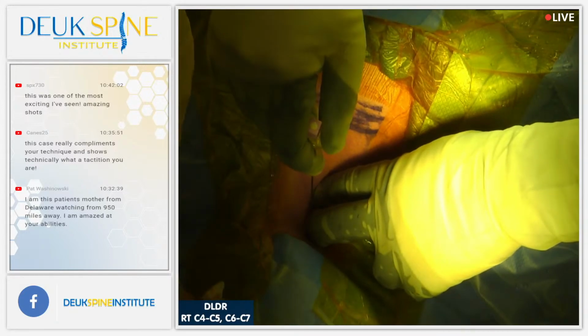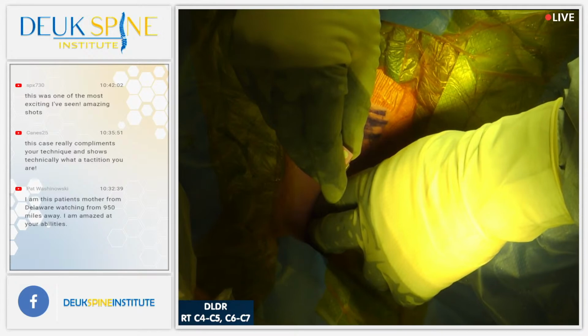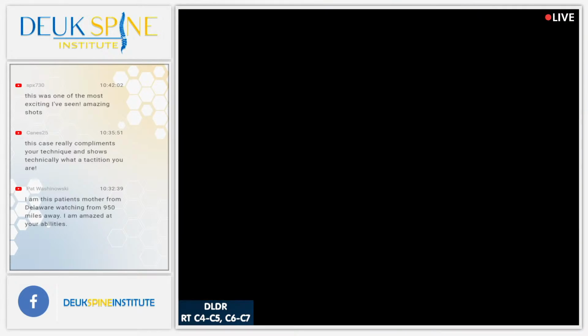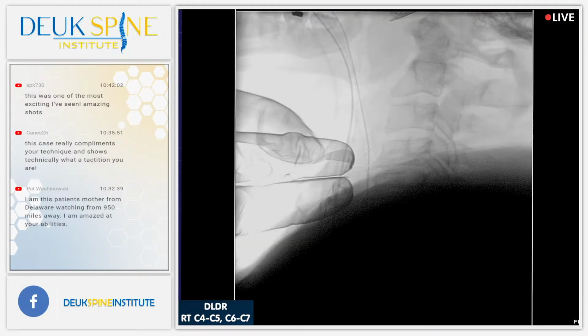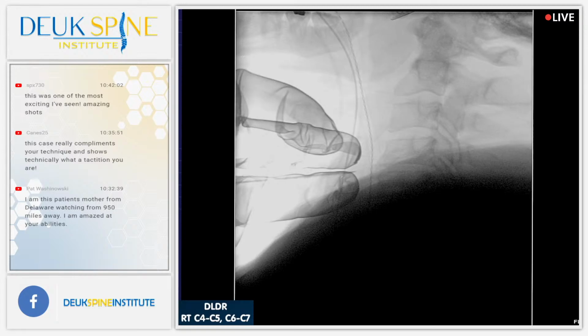All right, nice thing is I can feel his spine nicely with my fingertips. Shot. All right, so 2, 3, 4, 5. That's our next level, number 4, 5. It needs to go up just a little bit. Shot. All right, I'm right over the 4, 5 disc. Yeah, it could be a little bit more north. The neck is supple, which is really nice. It makes my job easier. Shot. All right, so that looks good to me. Let's get an AP and make sure we're in the middle.